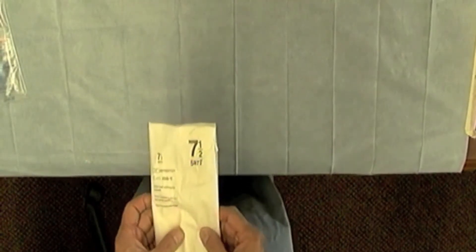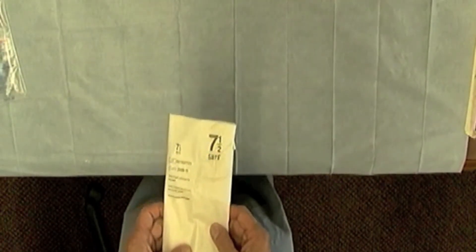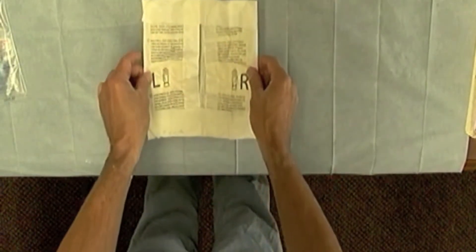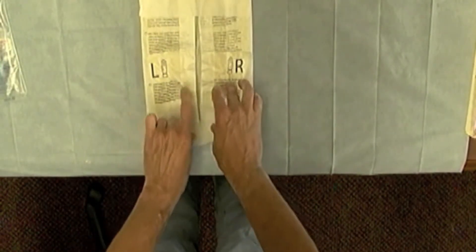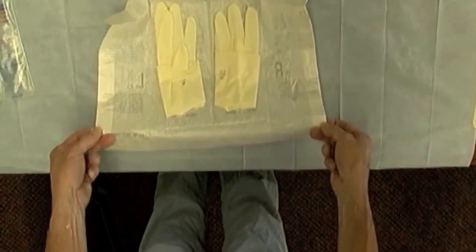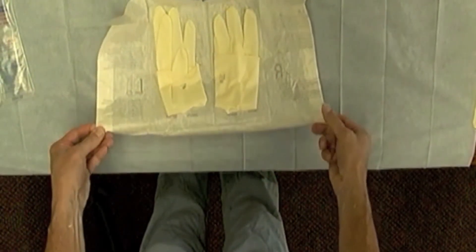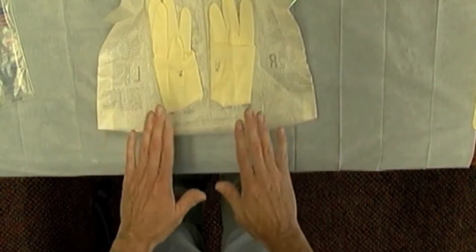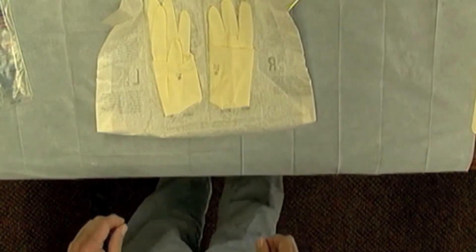You can use open gloving in the operating room, but the most common situations you'll be dealing with a field that's not sterile. So you have to be careful about how you put the glove pack onto the surface and open it. Generally speaking, we're opening the glove pack and then turning the corner near the surgeon down to make sure that the glove pack stays in an open position.